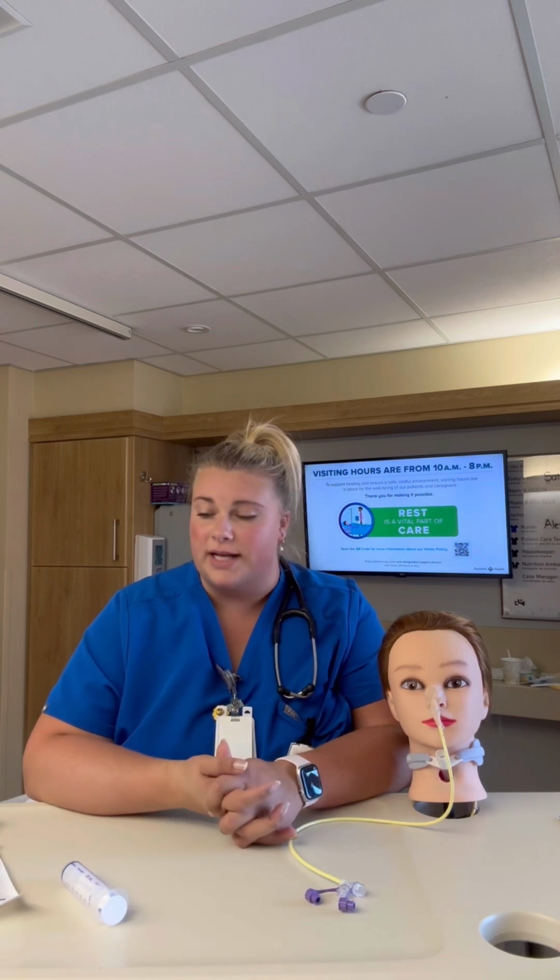As nurses, we also have a couple other tricks up our sleeve that we can do to confirm placement just for our own knowledge. But once again, the golden standard is that chest x-ray. Make sure you get it. One of the things that we can do as nurses is using a piston, we can insert air into our NG tube while holding the bell of our stethoscope over the stomach. We should hear gurgling if we're in the correct place.